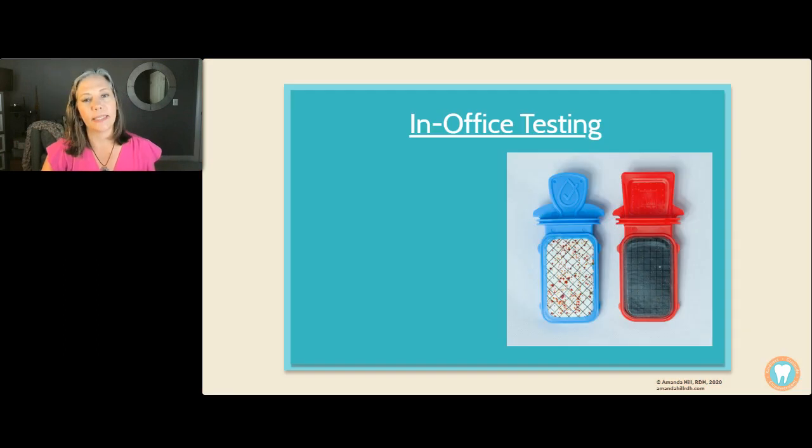So, in-office testing. In-office testing is 100% confidential. The very first time I ever did dental unit water lines, I did in-office testing because I knew we were going to fail. It was a 50-year-old office, and they'd never tested before. So I was like, oh, we're totally going to fail. So I shock tested, totally failed. It's confidential, so that's what we did.